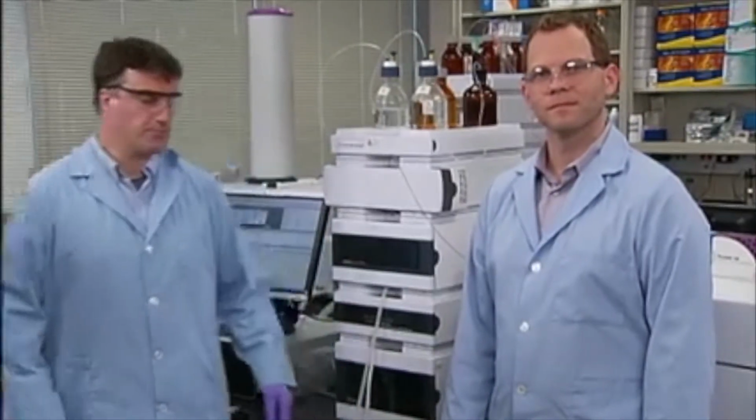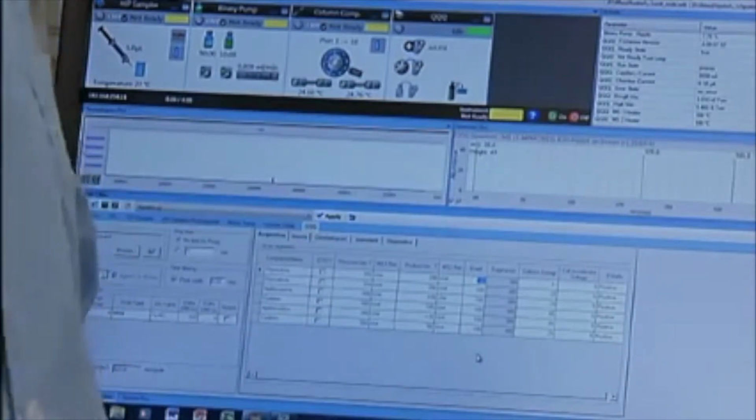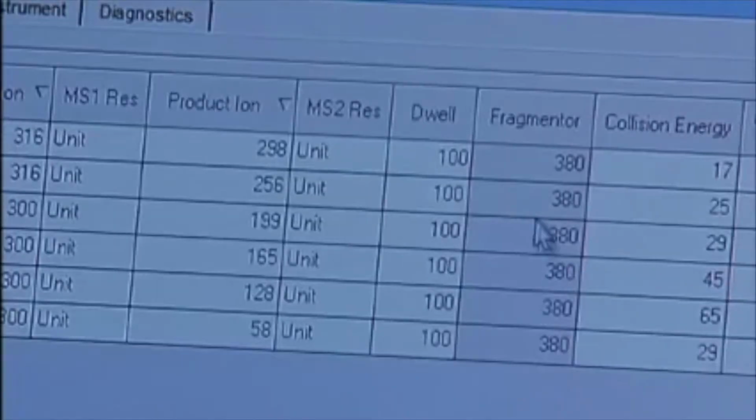Next, we want to make sure our detector response time is set correctly. Here, the scan speed of the mass spectrometer must be fast enough to acquire an adequate number of data points to define the narrow peaks generated using a fast LC column like Poroshell 120. The tighter the scan speed, the better, so you get sharper peaks and increased sensitivity. Our default setting is 100 milliseconds, and that will work well for this analysis with Poroshell 120. Generally, for reproducible quantitation, you want 15 to 20 data points across the narrowest peak.